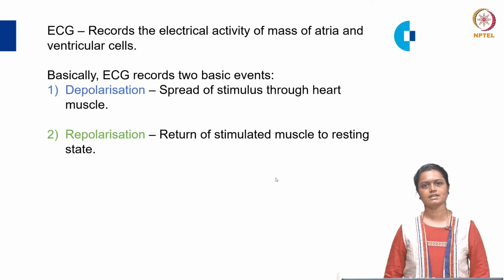So before discussing the waveforms in detail, I would like to tell some basic concepts related to electrocardiogram. We all know that the electrocardiogram records the electrical activity of the mass of atrial and ventricular muscle cells. Essentially, the electrocardiogram records two basic events which are termed depolarization and repolarization.